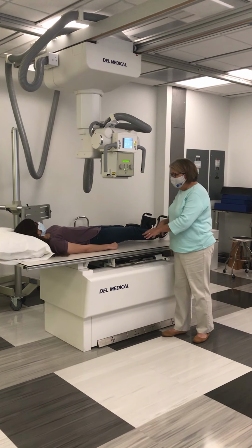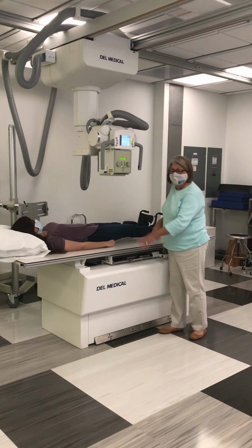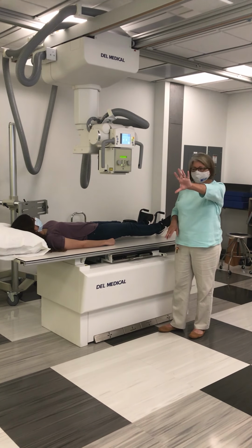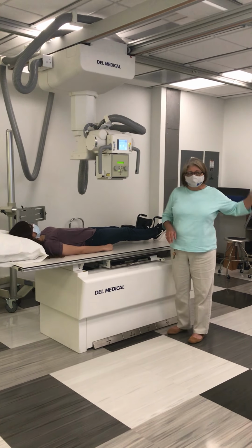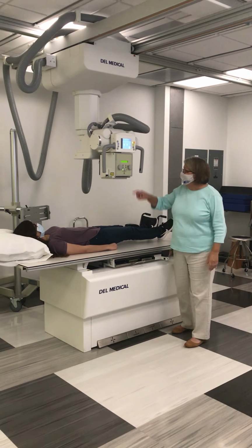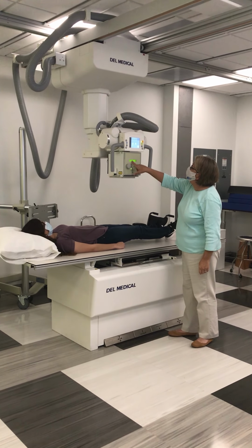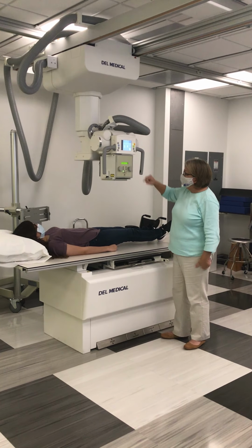So when you're working at the table using the table bucky, you don't have to go to the control panel to set your automatic collimation like you do when you're at the wall bucky. The readout here says 14 cross by 17 long. That's what we want.